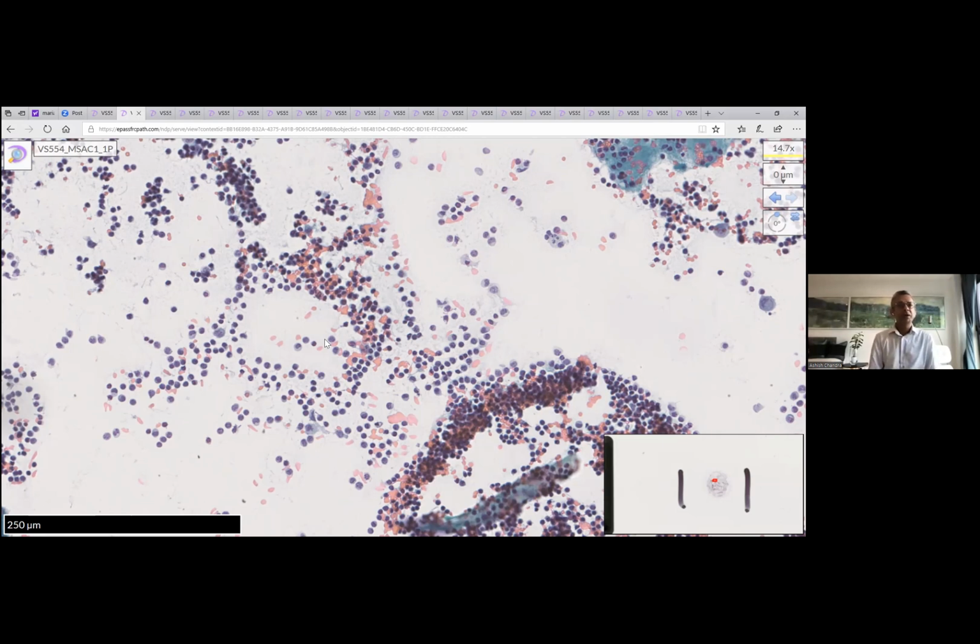So this is quite a mixed population, and it looks like a reactive population. With the high-grade lymphoma, of course, you would recognize, because all the cells will be large and will completely overtake any other cell populations on the slide, and it'll be just wall-to-wall packed with large lymphoid cells. The problem comes when they're all very much the same size, and they're bigger than your average mature lymphocytes, so they're kind of intermediate sized, and then you could have a differential diagnosis of a low-grade lymphoma.